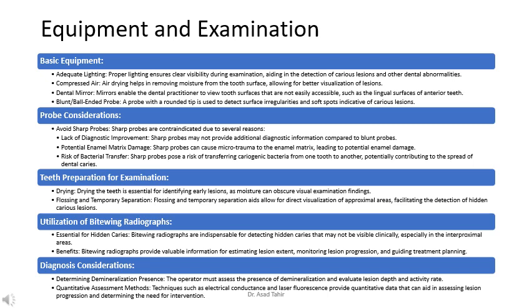Teeth preparation for examination. Drying. Drying the teeth is essential for identifying early lesions, as moisture can obscure visual examination findings. Flossing and temporary separation. Flossing and temporary separation aids allow for direct visualization of proximal areas, facilitating the detection of hidden carious lesions.